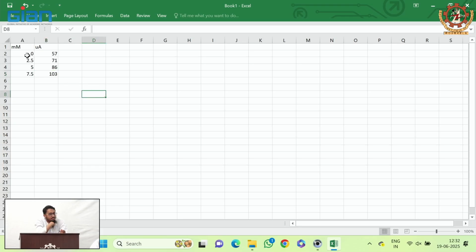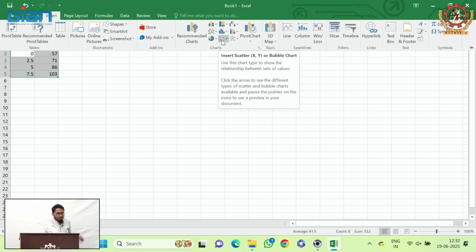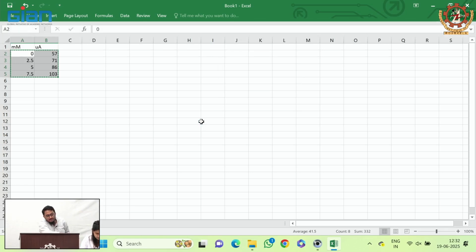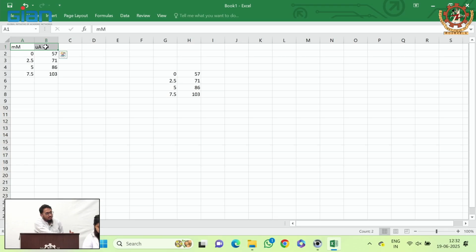Millimolar values are there. Okay. Actually, can you move the values to the center, because you cannot see them on the screen? Just copy it to the center. And the units also. Please write the units on the top so that people can see. Okay, now you can plot.